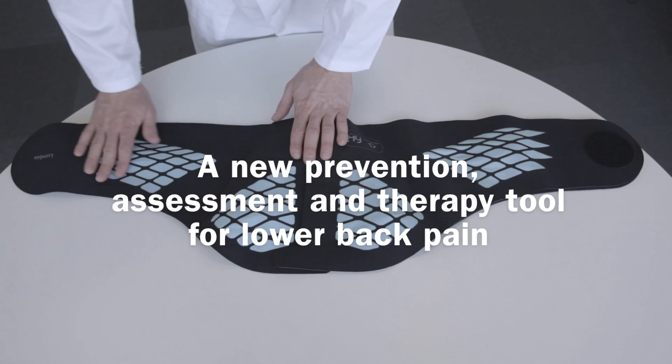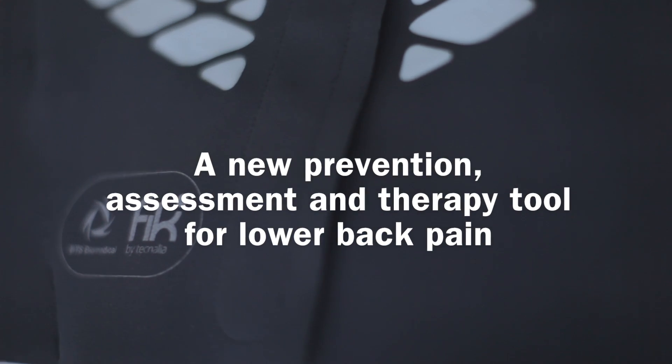Lumbia, a new prevention, assessment and therapy tool for lower back pain.